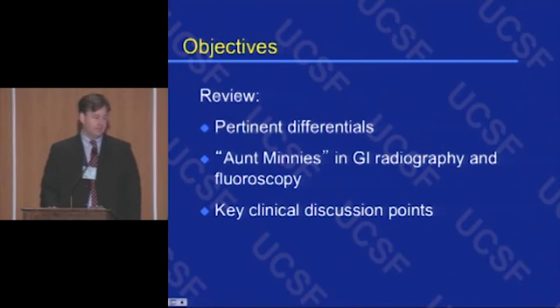So the objectives for this session are to review some of the pertinent differentials within fluoroscopy and radiography, highlight some of the anatomic variants, and of course along the way discuss some of the key clinical discussion points.